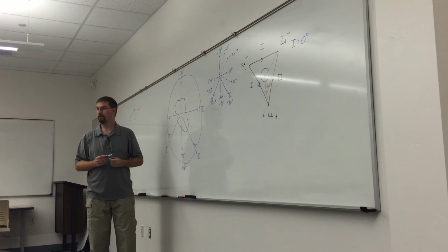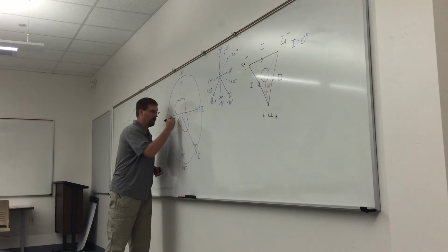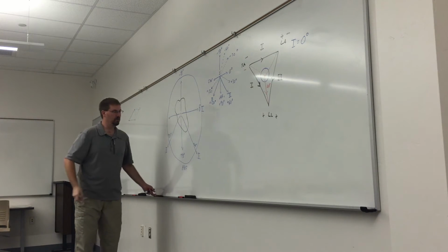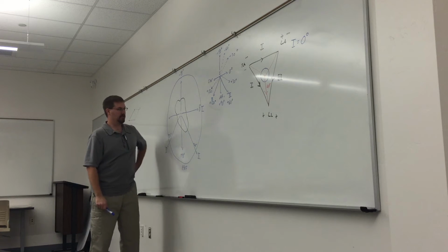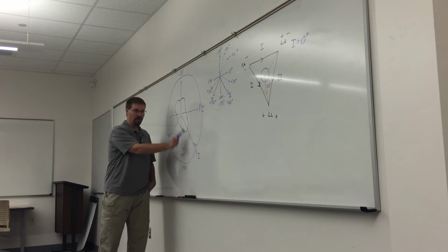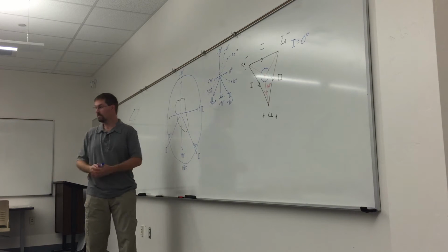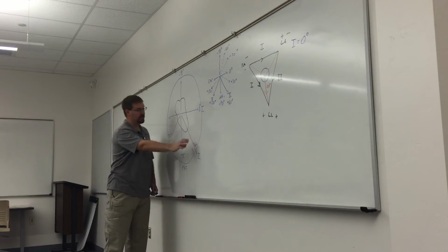Does that make sense? All right, so this is the axis system that we use. If you had to imagine where, degree-wise, my normal axis is more or less going to be? 60. Right around here on 60. Are you guys cool with that? So positive 60 degrees is more or less the normal axis. That's normally what we would see.